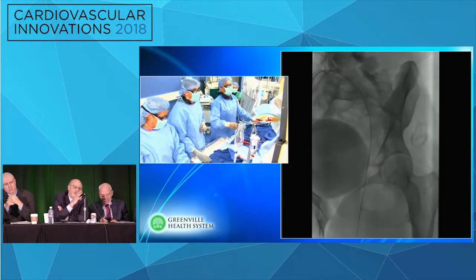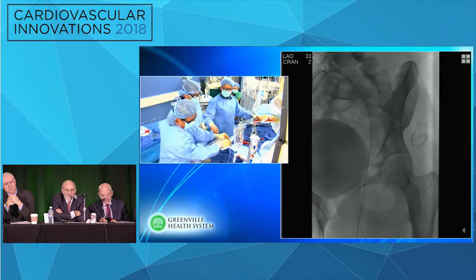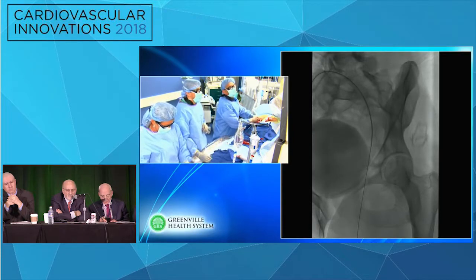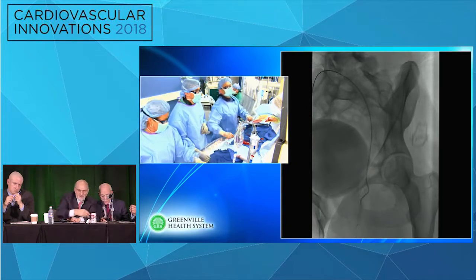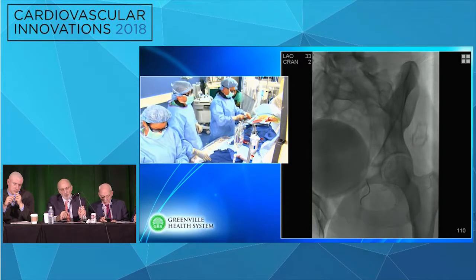Well, Kenny, I think, Bruce, why not stent from halfway up the femoral head, and that leaves your inflow. You have a lot of inflow, and there's less chance of fracture and so on. I don't know. That's probably what I would do. But Bruce is going by your original recommendation, Kenny. He wants to get into the deep vein now. Yeah, he wants to put a second wire and get into the deep vein.